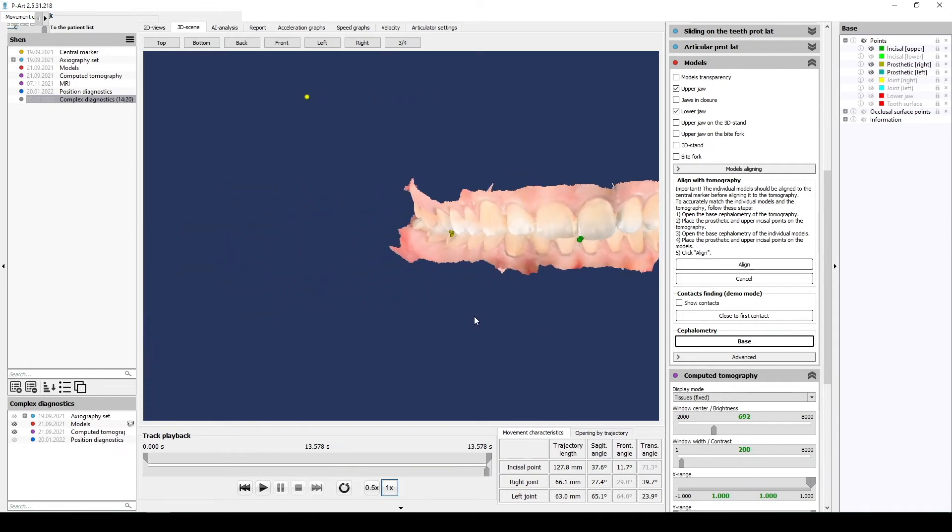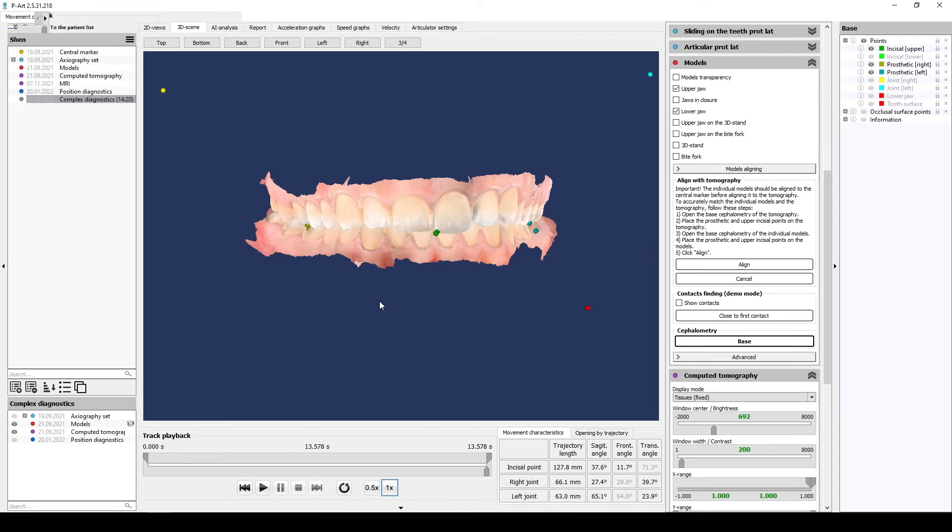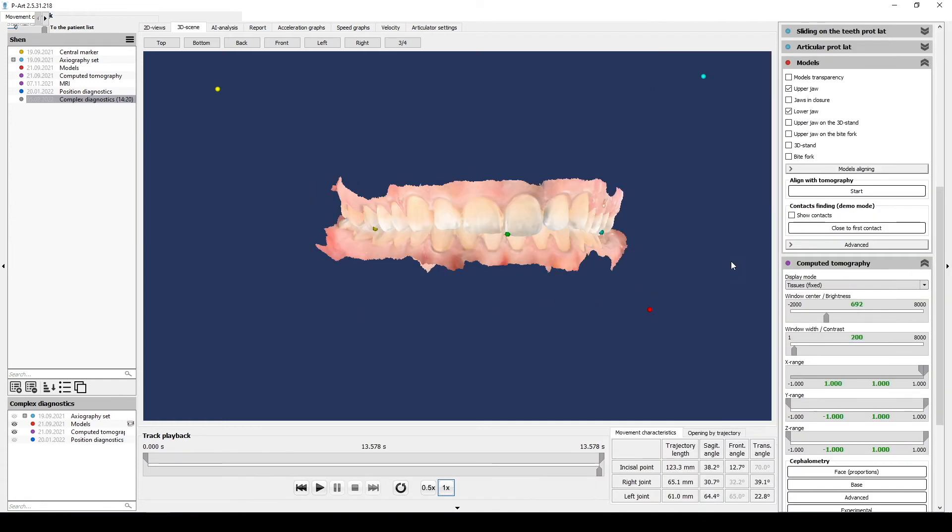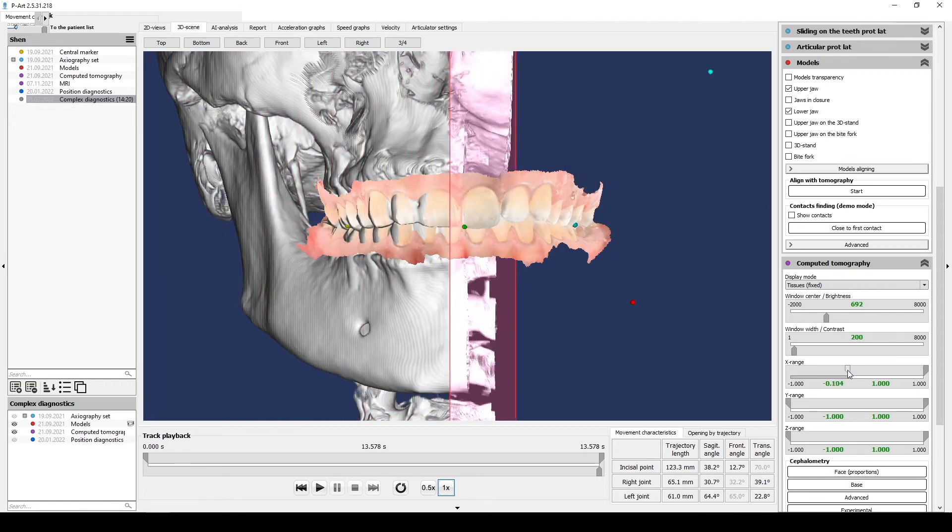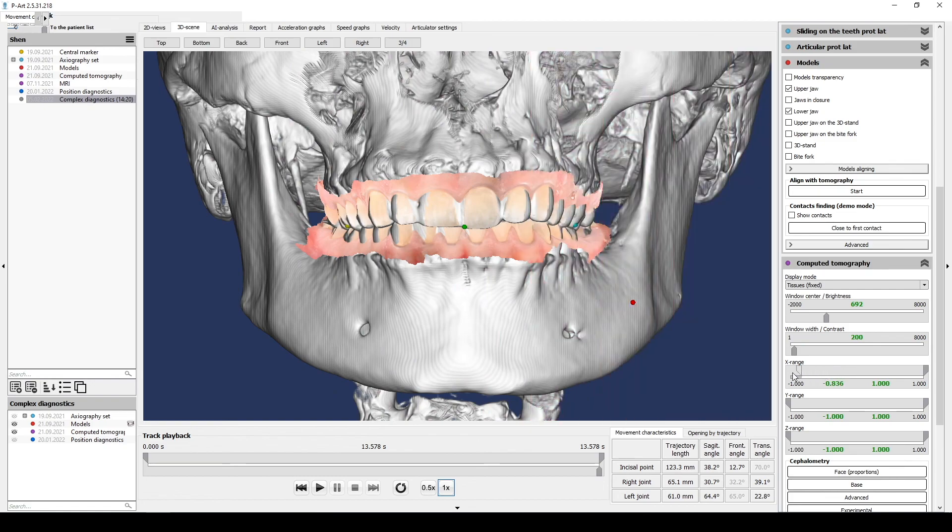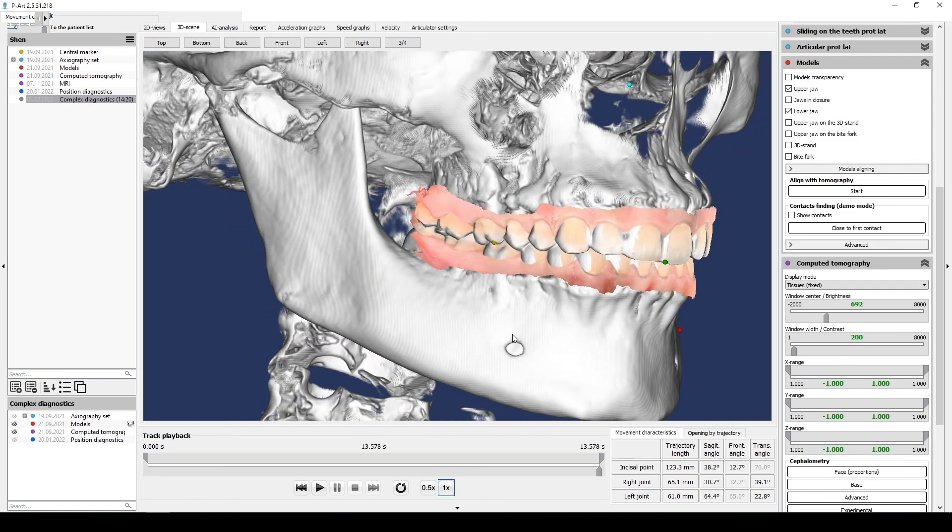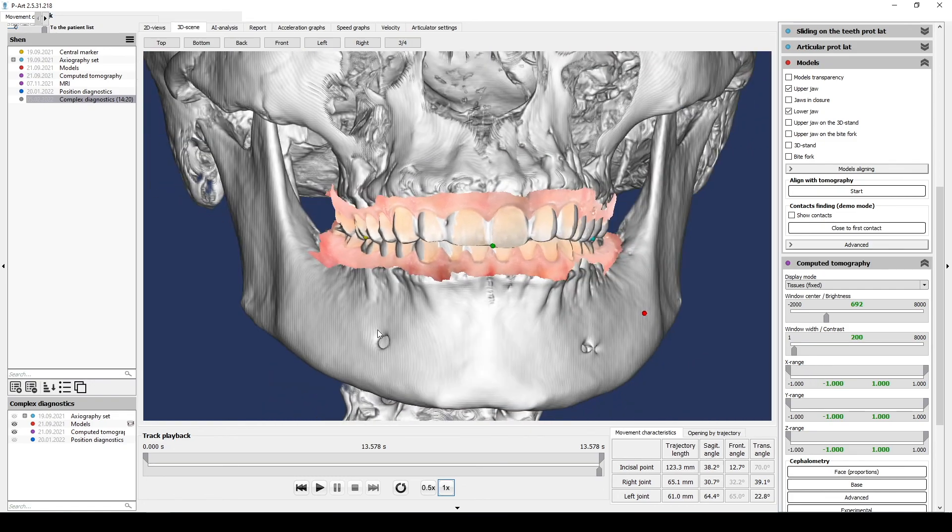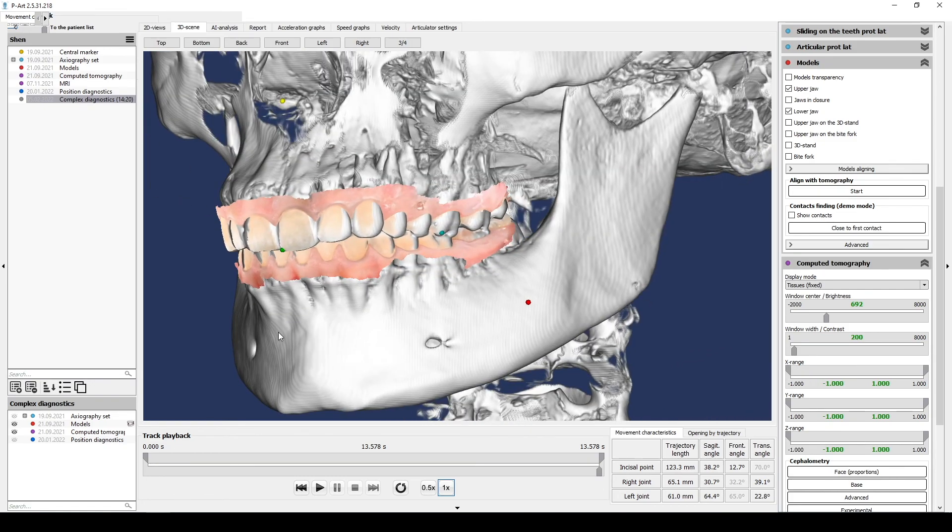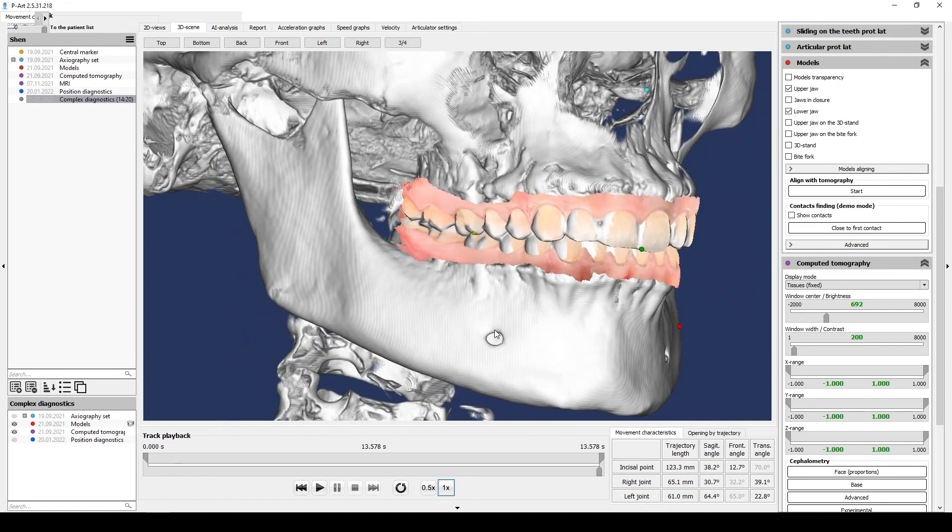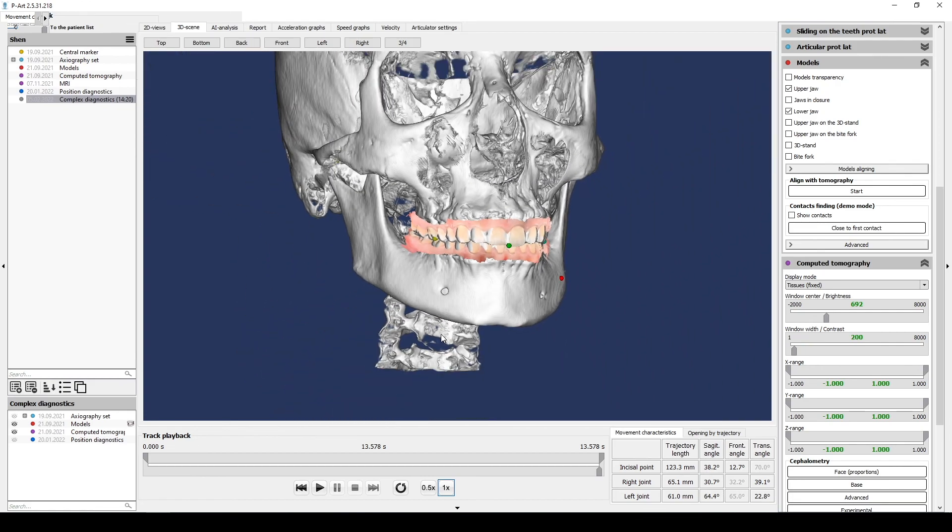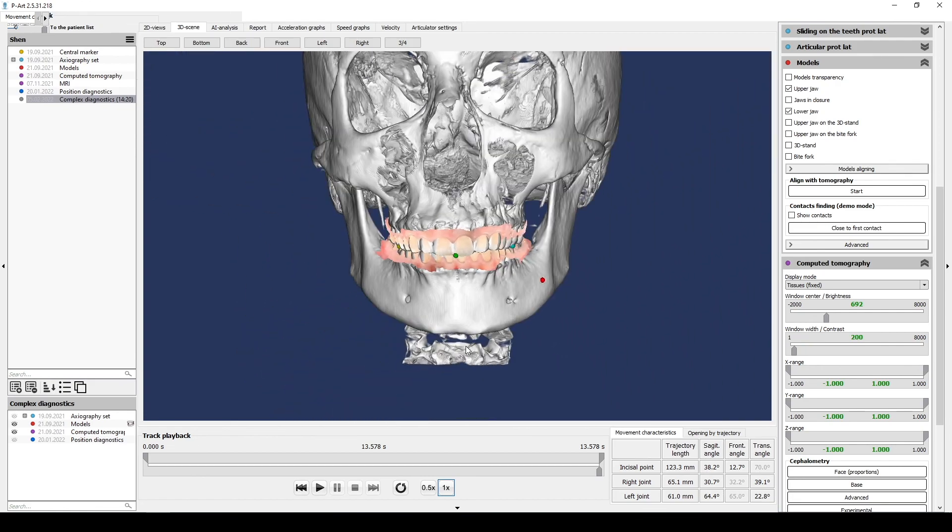When you finish, you are able to align CT and models. If your alignment has mistakes, check the positioning of the points and the difference in base CEPH of models and CT. Base cephalometric points from the tomography section should always be placed on CT; from individual models, only on models.